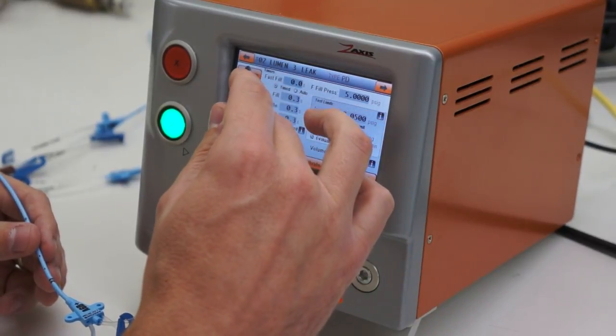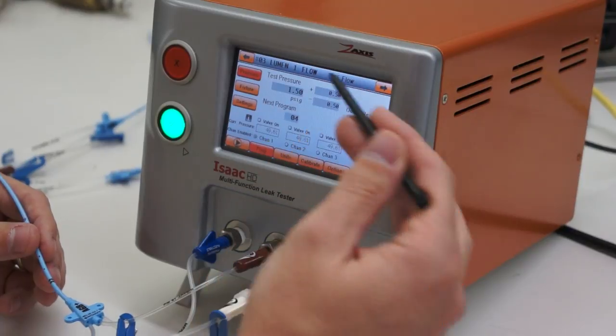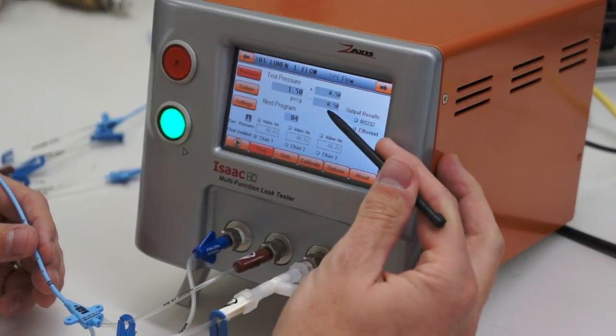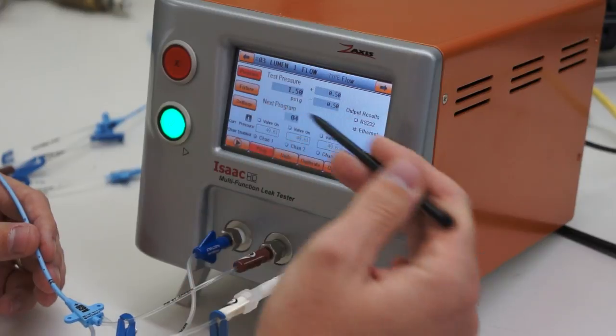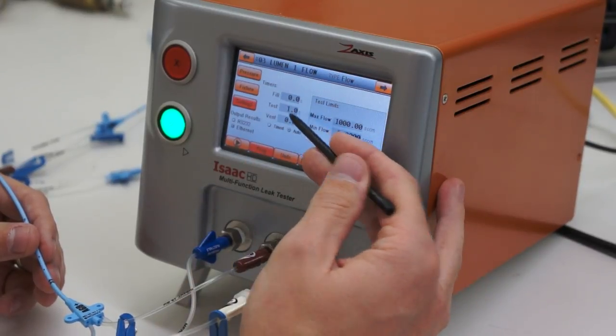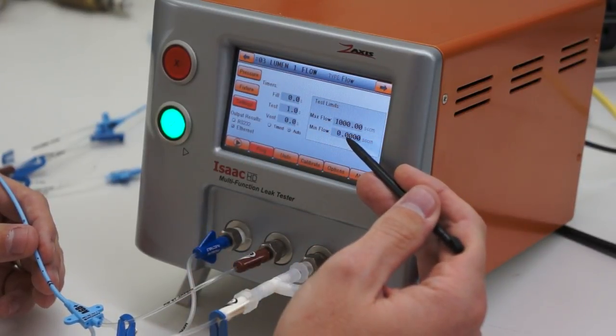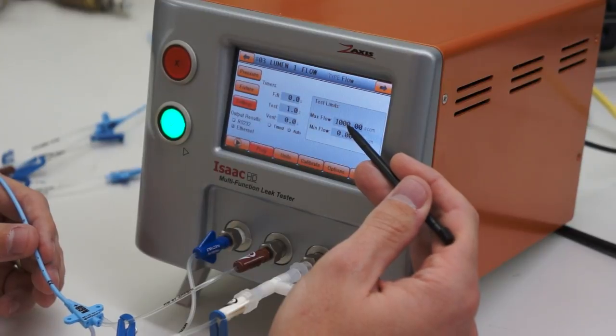The other test we do is a flow test done at 1.5 psi, plus and minus 0.5. We're testing for one second. We've set a minimum flow of 0 and a maximum flow of 1,000.